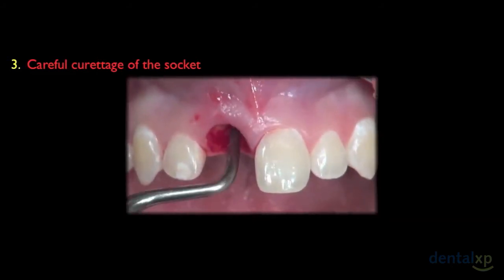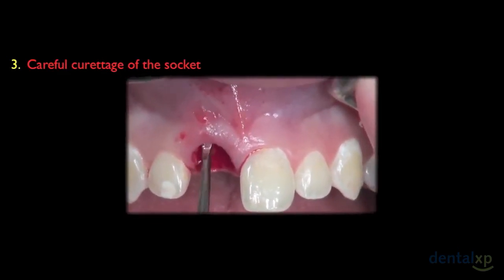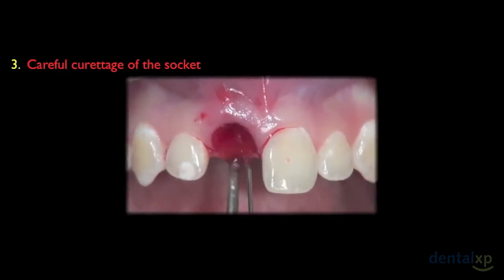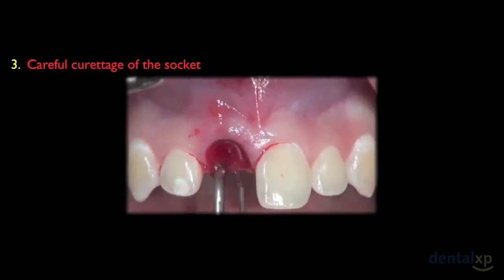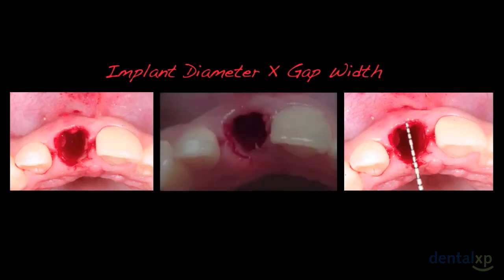The next step is careful curettage of the socket to remove granulation tissue and remains of the periodontal connective tissue. Be careful during this procedure not to traumatize the gingival tissue — neither the gingival margin nor the papilla — especially because we are working with very thin soft tissue. I suggest giving plenty of irrigation with saline solution to clean the socket as much as possible.